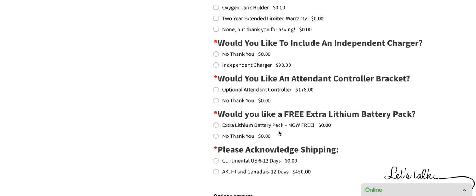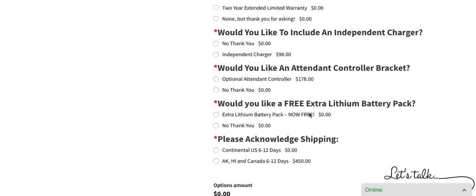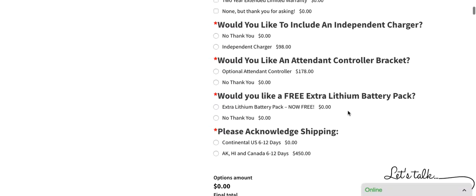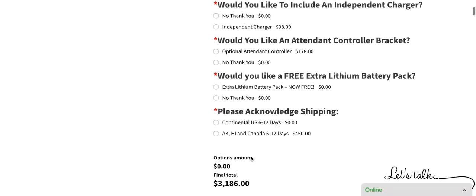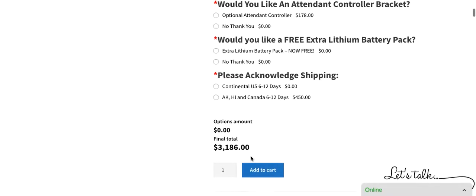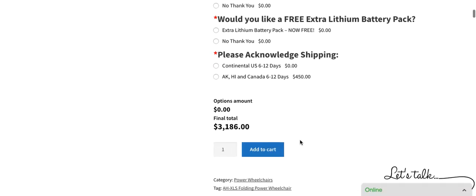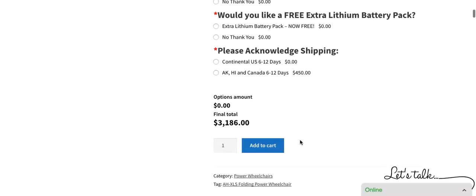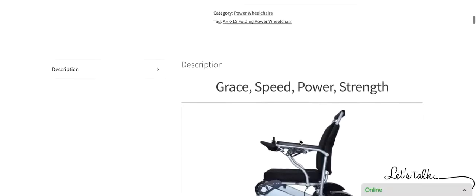We do give the option of an additional lithium battery pack for free. So in other words, it will come with two batteries instead of one. It only takes one to operate the chair. Shipping in the U.S. typically takes between 6 and 12 days and we can, for an additional fee, ship to Alaska, Hawaii, and Canada. The total cost is $3,186. Now, let's move on to the features.